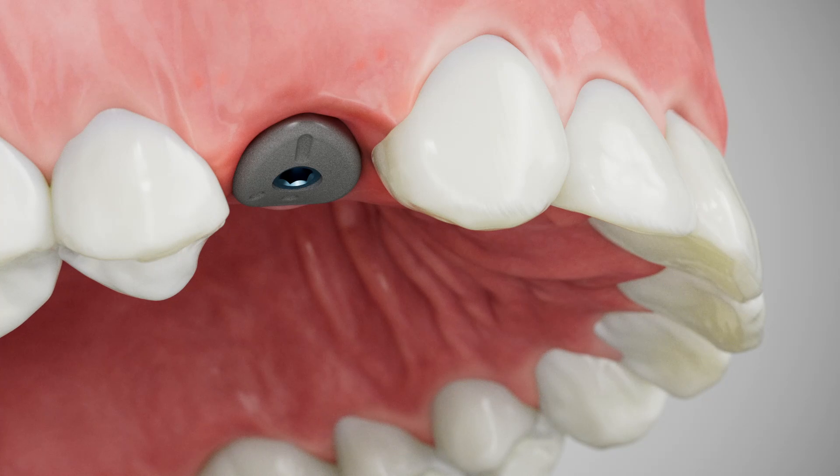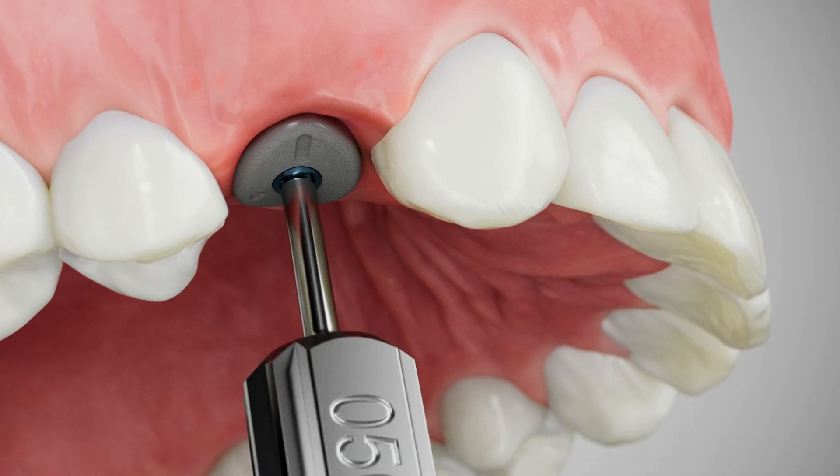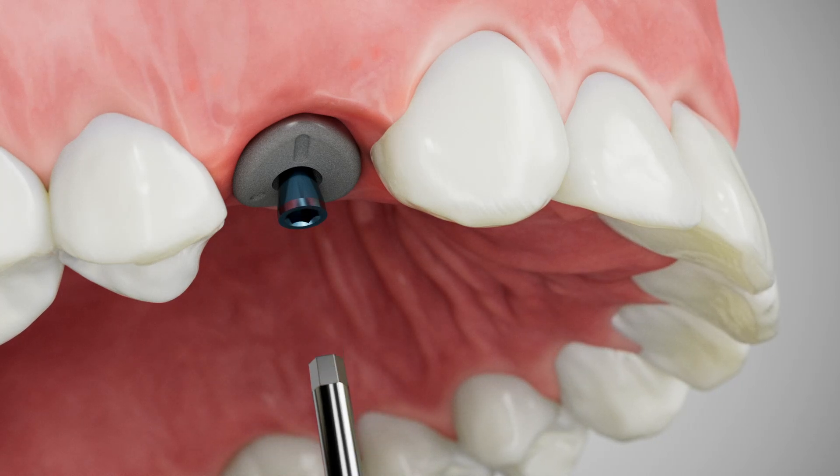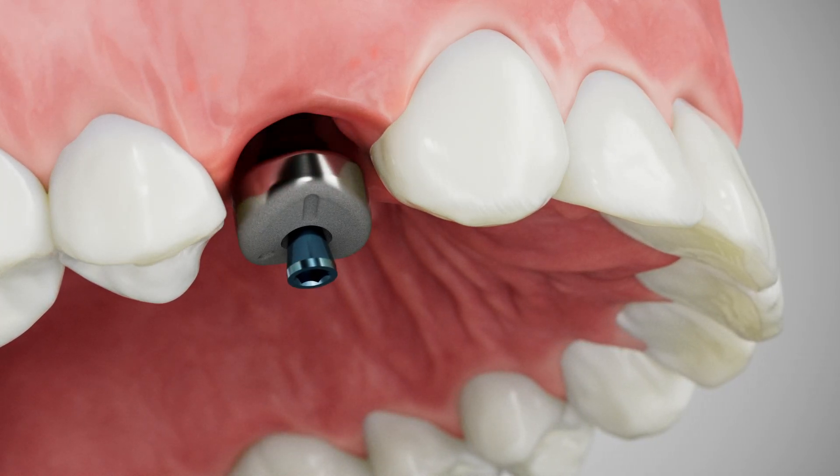Remove the SmartShape healer using an 050 hex driver. The abutment screw can be used as a carrier to help extract the healing abutment.